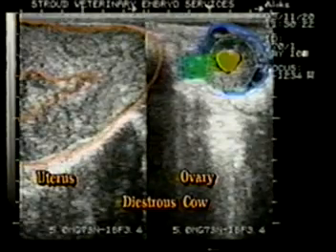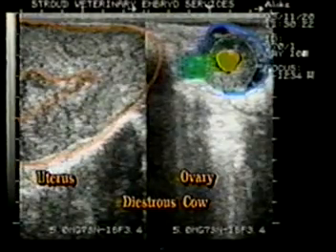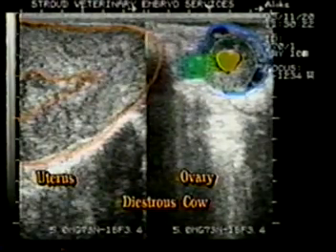The green structure on the right half of the screen represents the papillum of the CL. The yellow is the fluid-filled portion of the normal CL. The white line outlines the homogeneous CL. The blue line outlines the entire ovary.